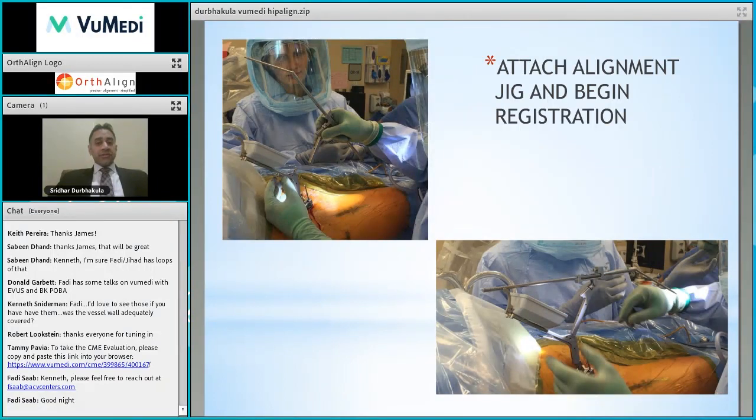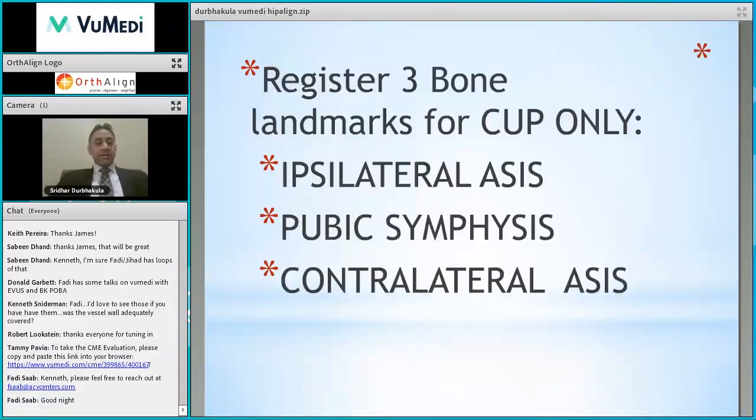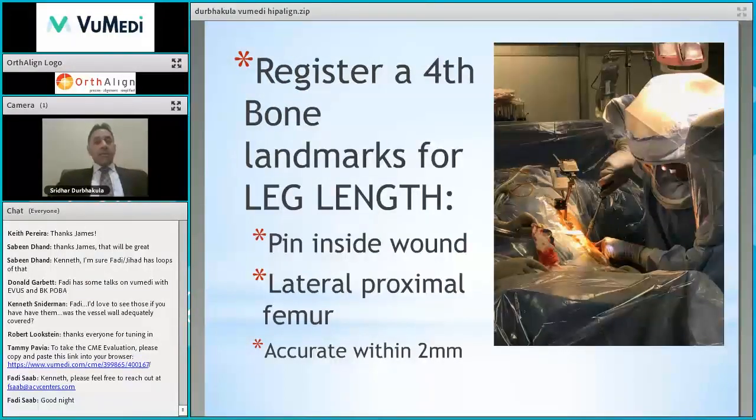This is our registration. Again, we've talked a little bit about this already, but basically for the pelvis, we're looking at the anterior pelvic plane. Essentially, we're getting ipsilateral and contralateral ASIS and the pubic symphysis. When we talk about the leg length, we add a fourth bony landmark.